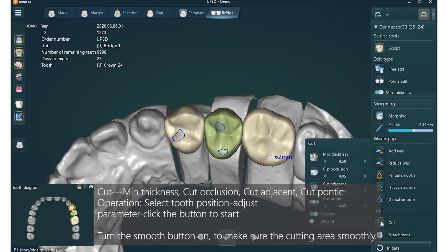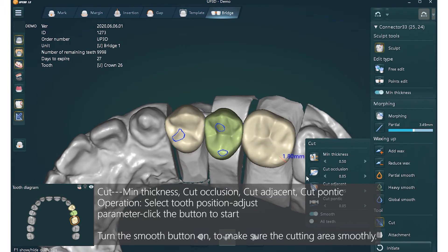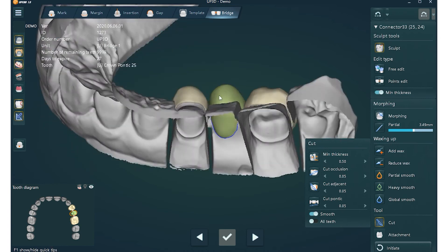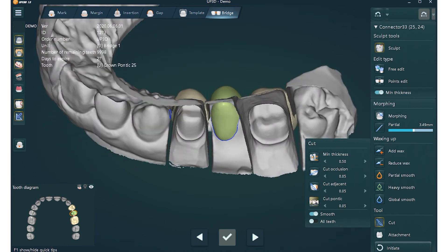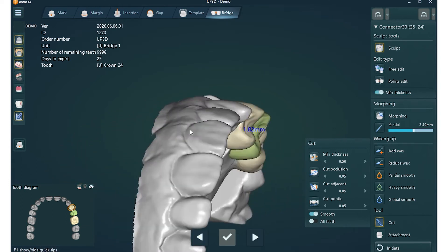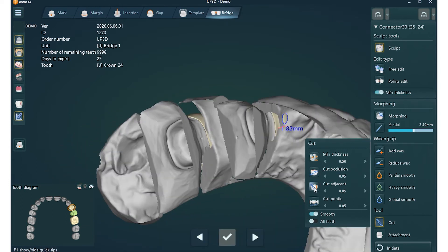Cut functions include: minimum thickness, cut, occlusion, cut adjacent, cut pontic. For operation: select the tooth position, adjust the parameter, then click the button to start. Turn the smooth button on to make sure the cutting area is smooth. Use the minimum thickness function when the crown thickness cannot meet requirements. Use the cut function when the crown collides.